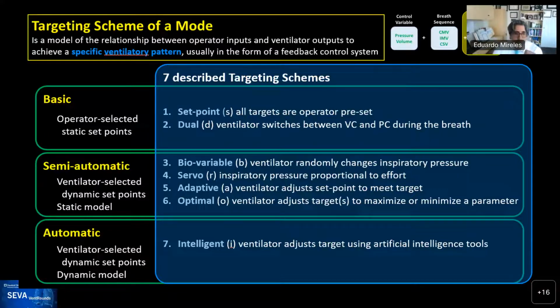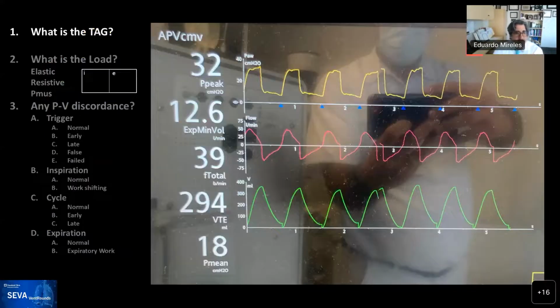All right, great job. So with that we start, and the ask over here is that as you look at this, and I was very intentional on keeping the commercial name so that we can discuss that, the ask for you right now is to tell us what is the tag for this mode, and you can write it on the chat. Have no fear.